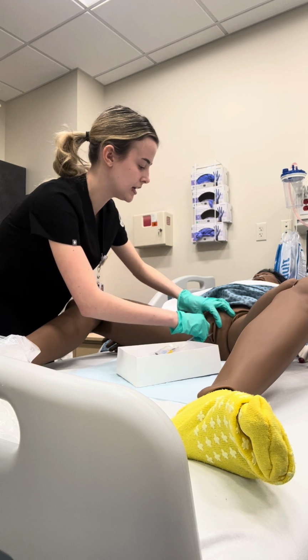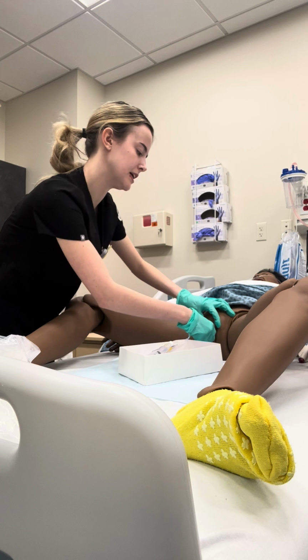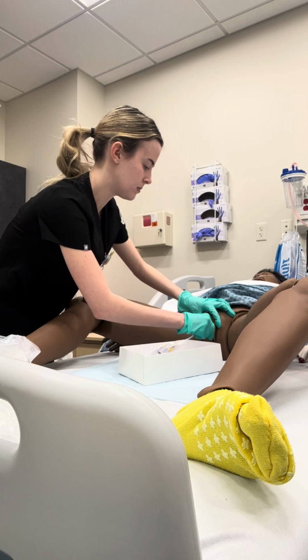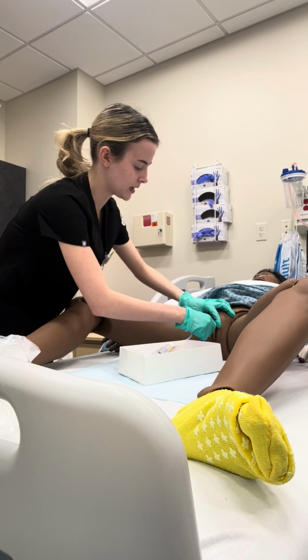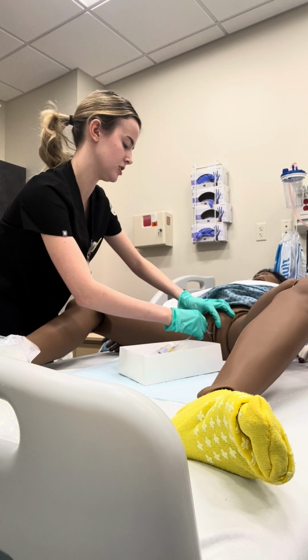I'm just inserting until I get urinary feedback. So I've got urinary feedback and I'm going to insert 2 more inches. Okay, and once I've inserted 2 more inches, I'm going to let go with my non-dominant hand.